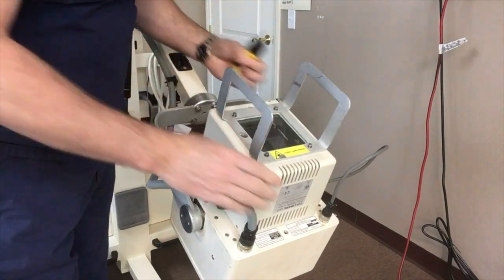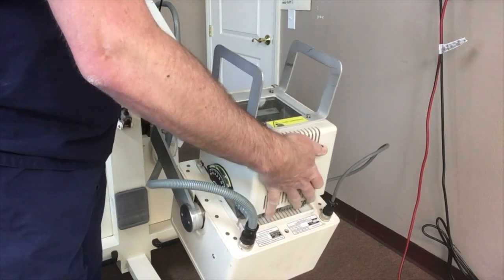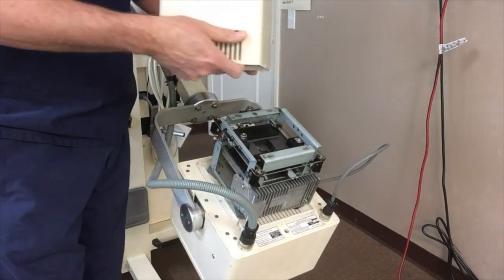Once you've got these all loose, remove the housing — you turn it up towards the buttons and it removes.